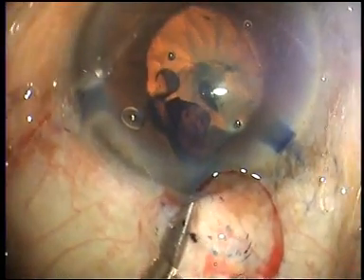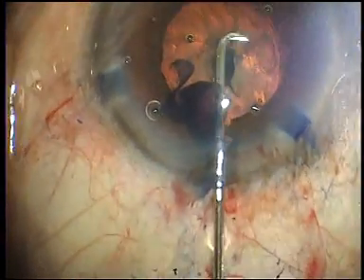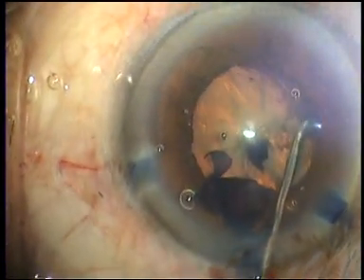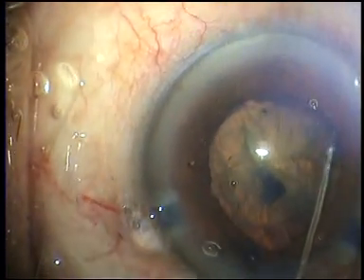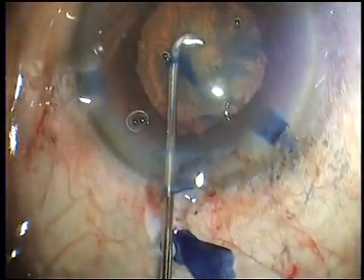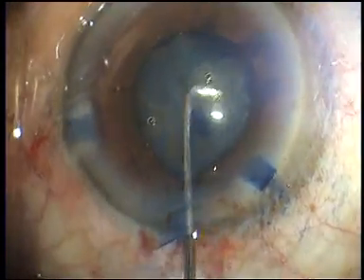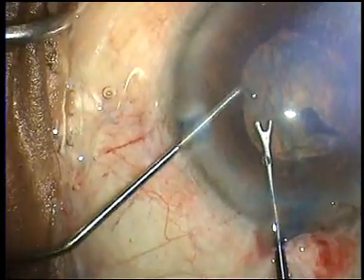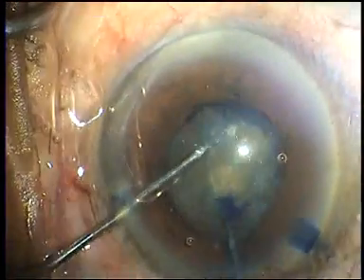A little viscoelastic is burped out of the anterior chamber to allow for an easy fluid wave to pass across the equator of the lens and up through the contralateral equator on the other side. My preferred instrument for hydrodissection is the Chang hydrodissection cannula. There is slight decompression of the lens as it moves forward, and this allows for the full flow of fluid right across the lens.